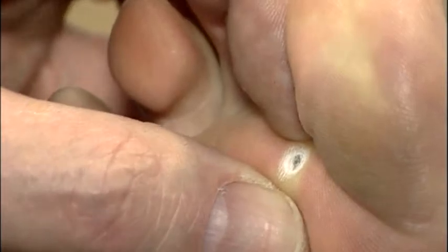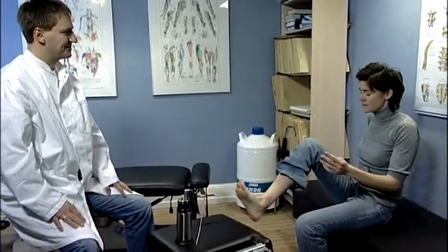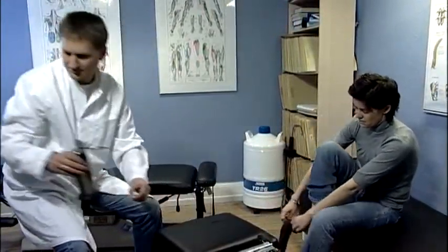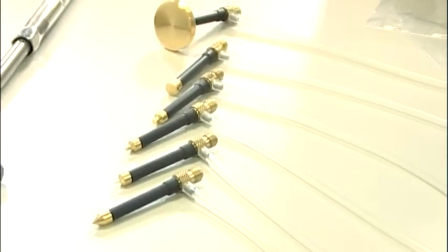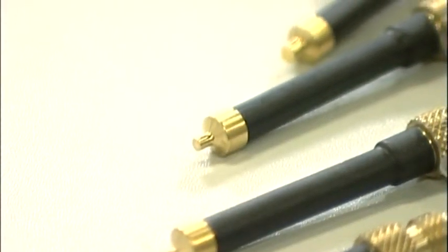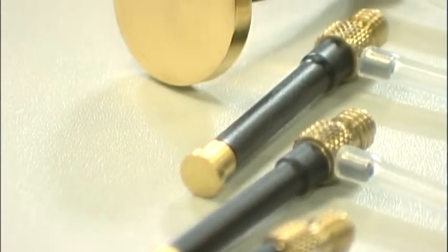The freezing time depends on the type of lesion as well as the operator's personal preferences. But 10 to 15 seconds of continuous freezing covers a broad spectrum of applications. Guidelines regarding freezing times and choice of spray or contact freezing can be found in the enclosed manual or in relevant literature. The probe is in direct skin contact and autoclaving at 121 degrees Celsius for 15 minutes is recommended.